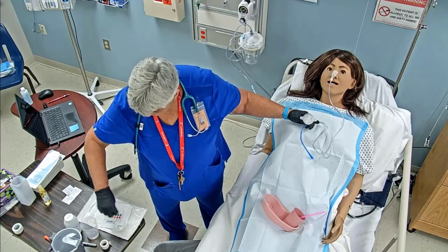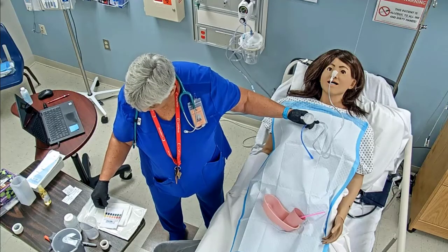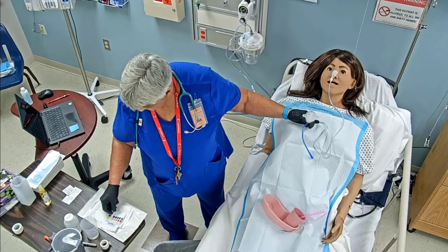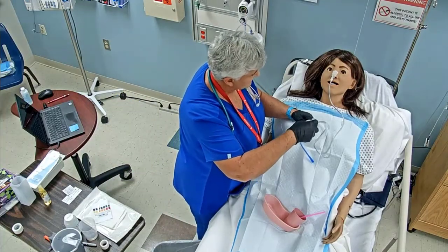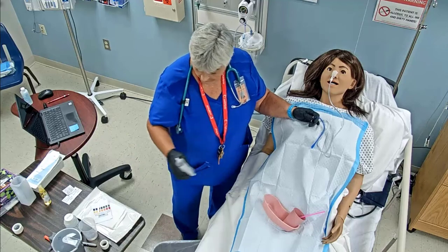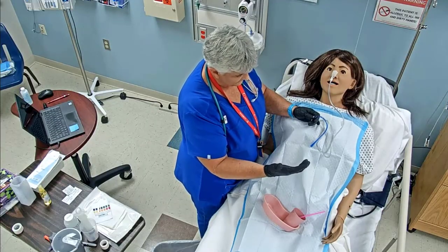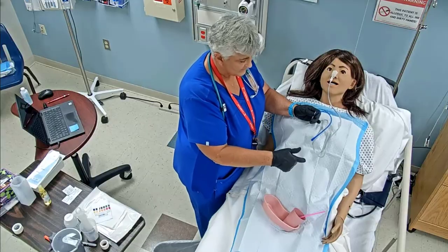We need to make sure that it is 5.5 or below, and I'm going to note what it is. This one is 4, so that is good. Now that we've done that, I'm going to take this off, put the call light on and ask someone to call down to get an x-ray, because we've got to confirm the placement. So we checked the pH, and we're also doing an x-ray. Before we can use this, we have to confirm it with our x-ray.